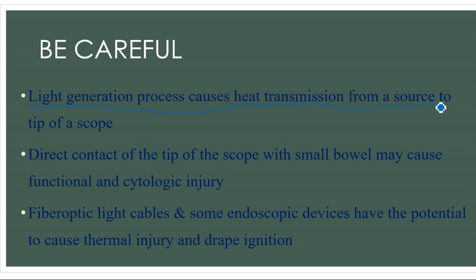But yes, after 3 days or 5 days, the patient may present to us with features of perforation peritonitis. So please avoid touching the tip of the scope while operating any patient. Don't touch the tip of the laparoscope with any organ.